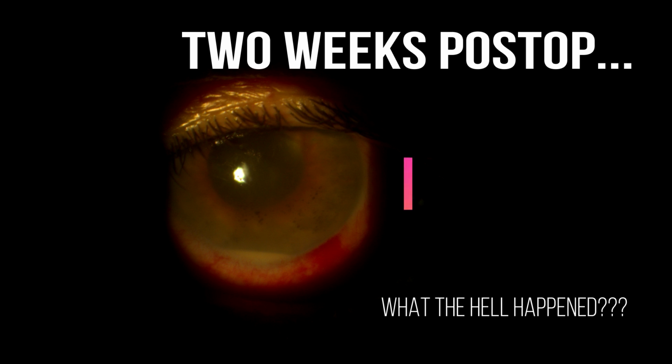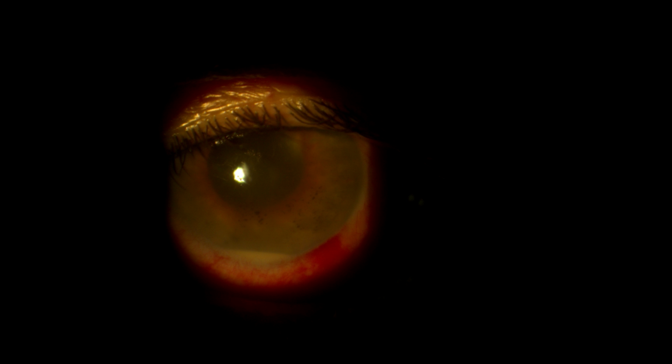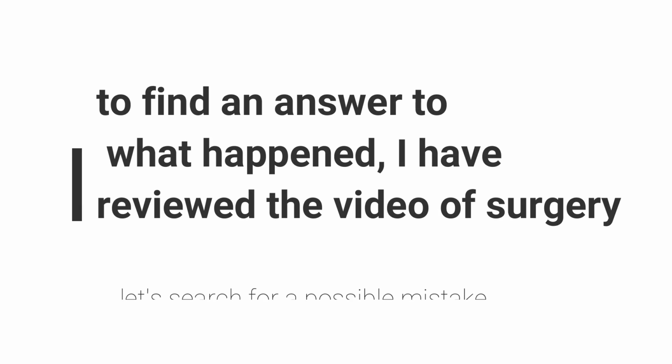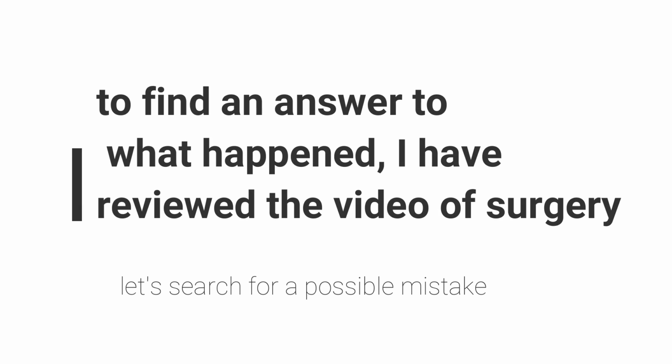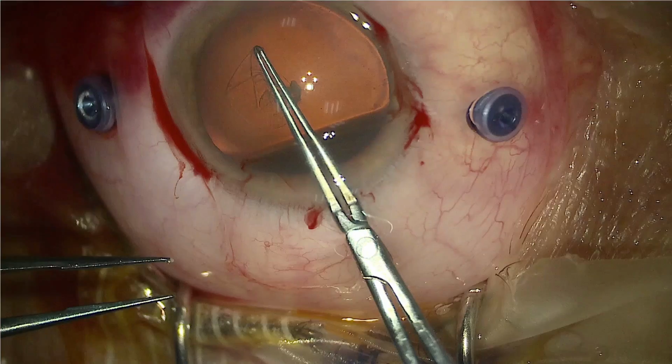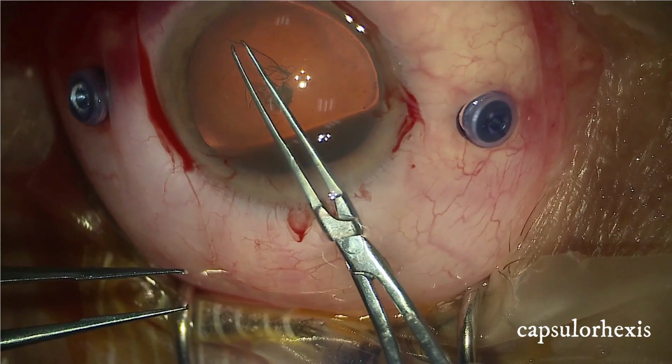2 weeks post-op, it looks very bad with one haptic of the IOL in the sulcus, tyndall, iritis, the retina is attached, but what happened? So I have reviewed the video of the surgery trying to understand.